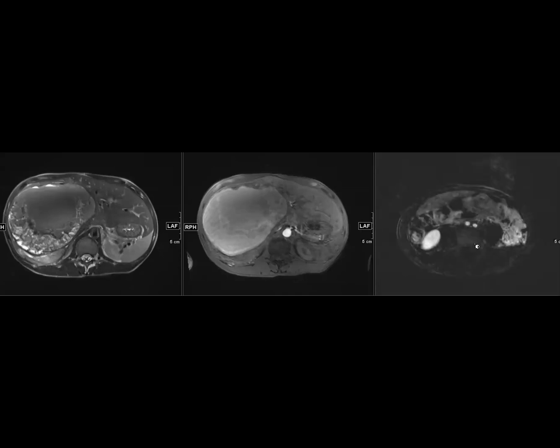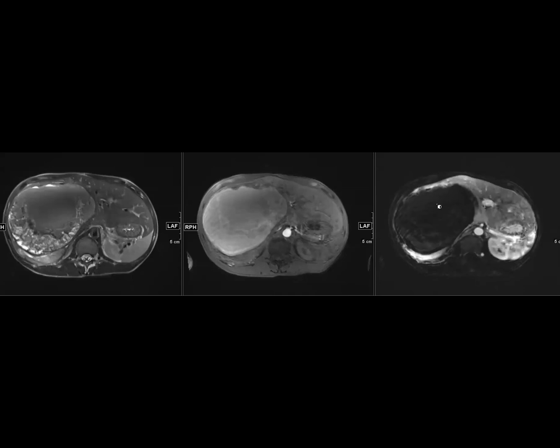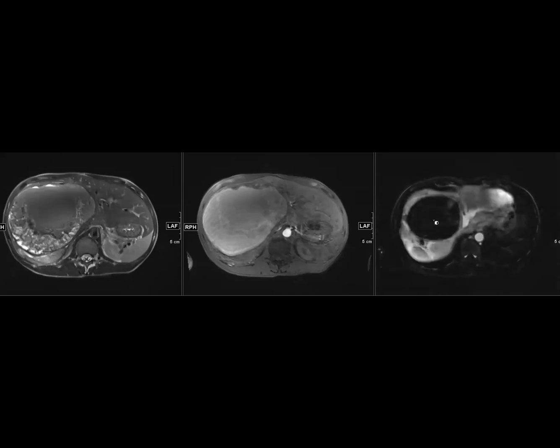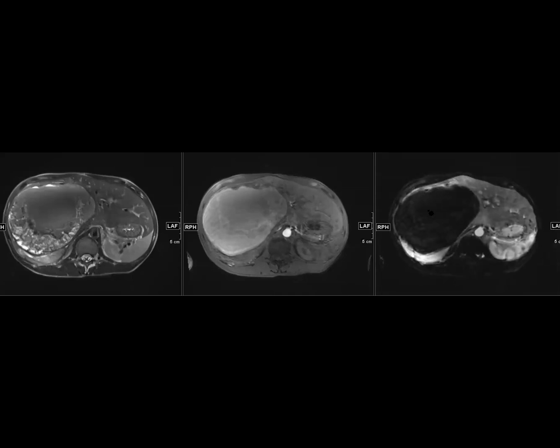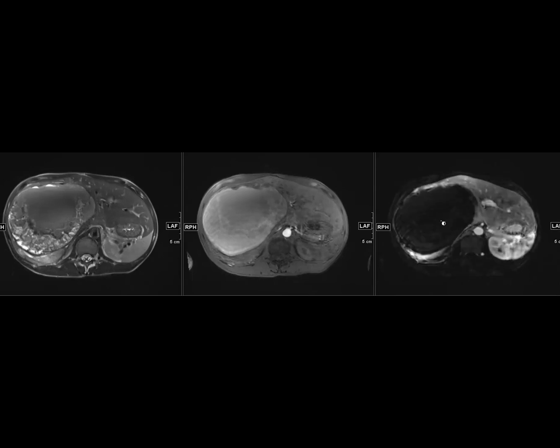You can see that this is on the periphery, you can see nodular remaining solid tissue, but the bulk of the mass is not. So this is a non-cirrhotic alcoholic patient, 40, just incidentally found to have some abnormality in the liver on a physical exam. So any thoughts? This is pretty crazy looking.